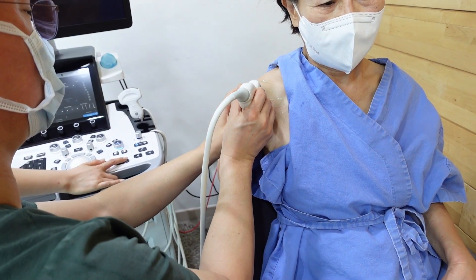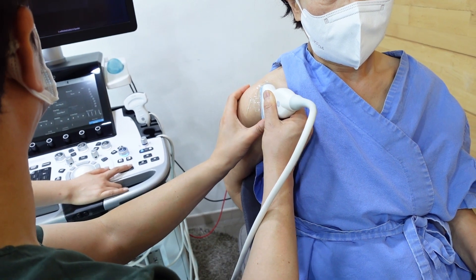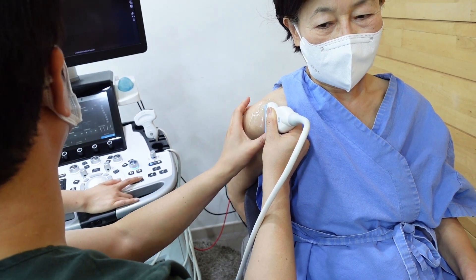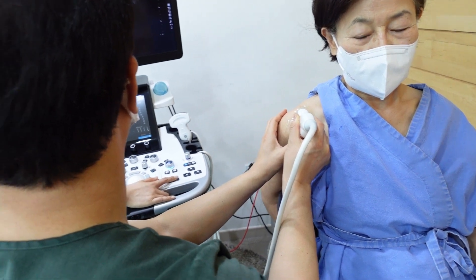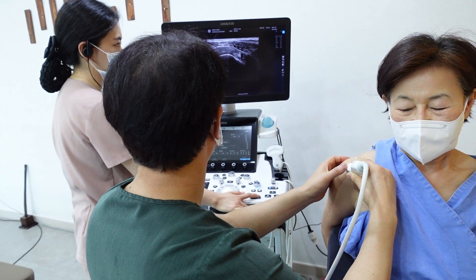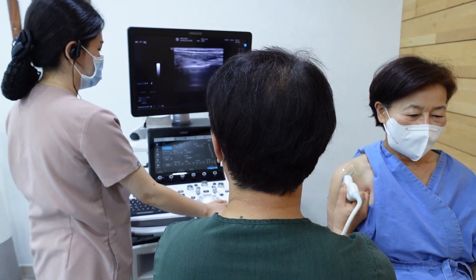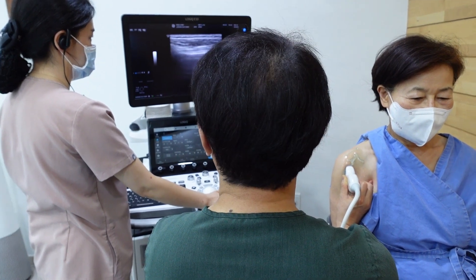Tilting: to improve visualization and minimize artifacts, tilt the probe either side to side — called lateral tilt — or from cranial to caudal — called longitudinal tilt. This helps you obtain a better view of the target structure by adjusting the angle of incidence of the ultrasound waves. Rotation: rotate the probe to align the structure of interest for longitudinal, transverse, or oblique views. This technique allows you to examine the target from different perspectives and obtain comprehensive information about its shape, size, and orientation.